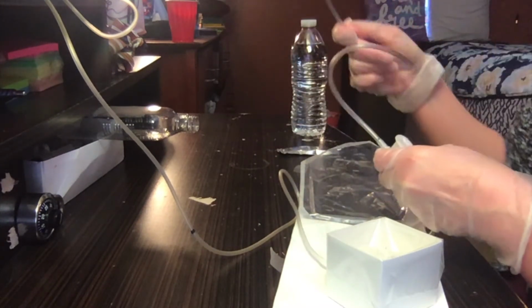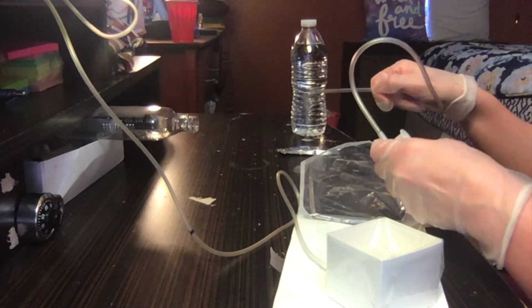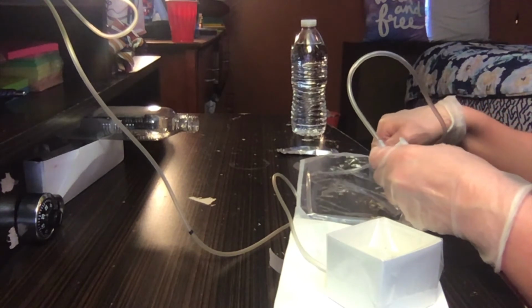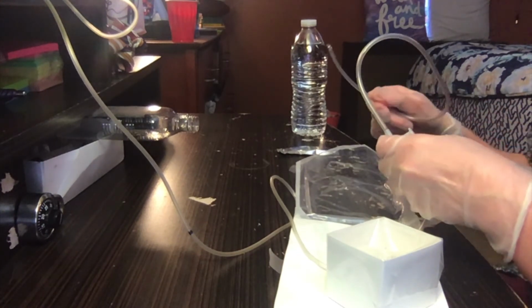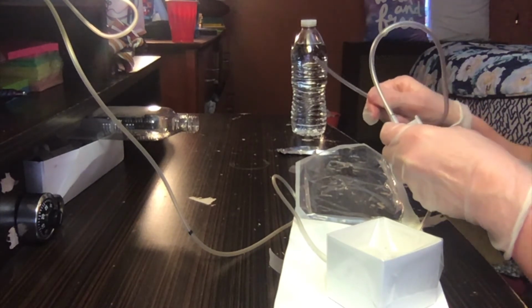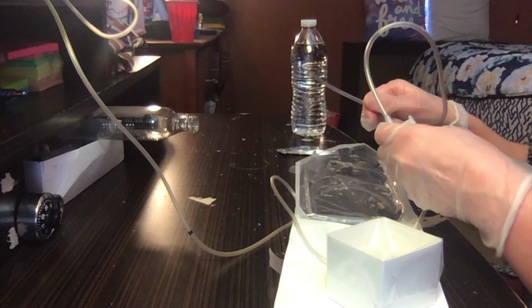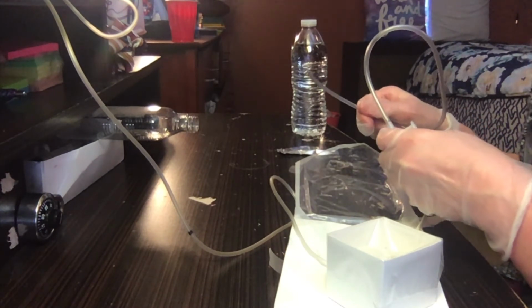I'm going to ask the patient to take a couple deep breaths, and I'm going to lubricate the tip of the catheter 2 to 3 inches. And then, as I'm doing this, I'm going to take away the oxygen before I start suctioning the patient. And without touching the patient's face, I'm going to measure the distance for insertion from the patient's earlobe to the nose. This will ensure proper placement.